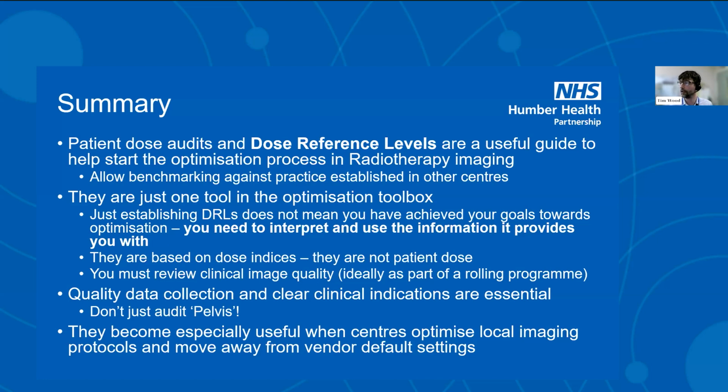Quality data collection is key. So like I say, it's about prostate and gynae, it's not about pelvis audits. And it's most useful when you start to deviate, when you start to optimize your practice locally, because you're not going to be that one value on a graph anymore.